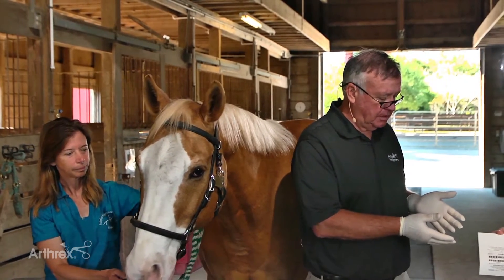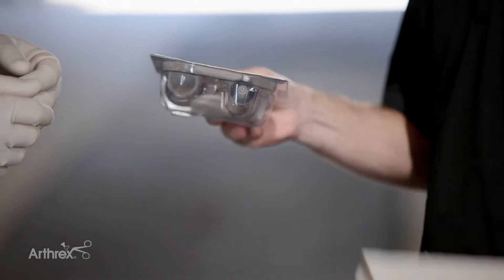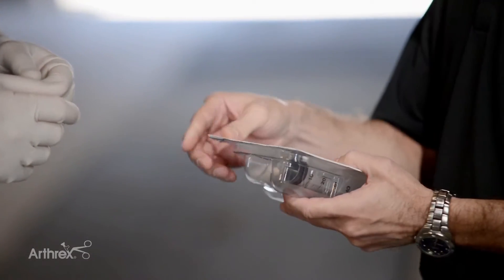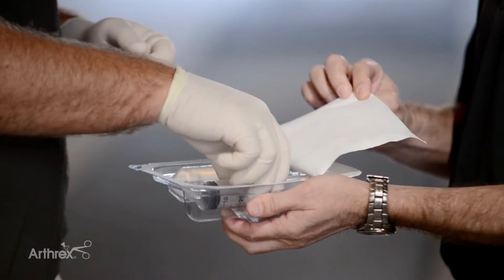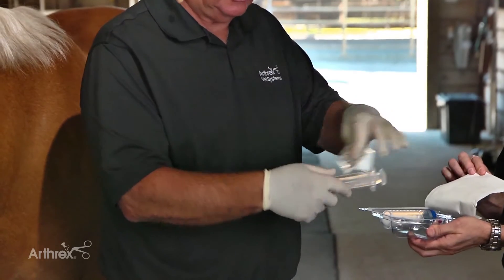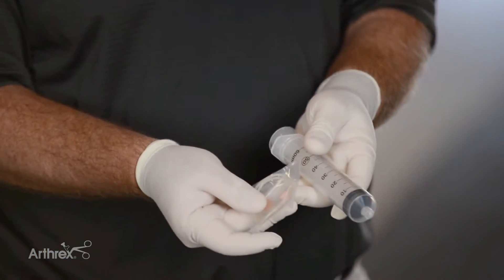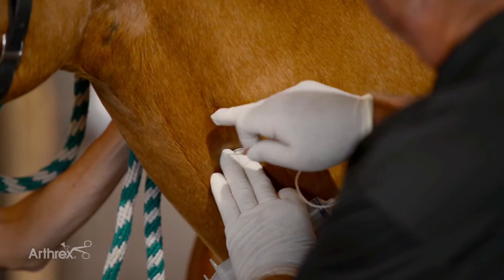The IRAP2 system comes in a box where the inside is sterile. Have your assistant pull up from this corner without putting their hands in the side. We go ahead and get the syringe and your needle, attach the needle to the syringe, and then go ahead and do our venipuncture.